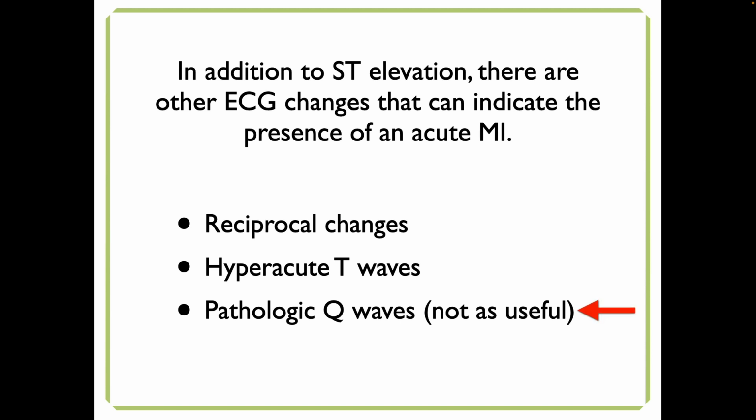Q waves. What is a Q wave? Grace, which part of the QRS is a Q wave? How do you define a Q wave? The first what? Negative or positive? Oh, the first negative deflection. Yes, okay. So the first negative deflection before the R wave, unless there is no R wave, and then it's just the first negative deflection, okay?